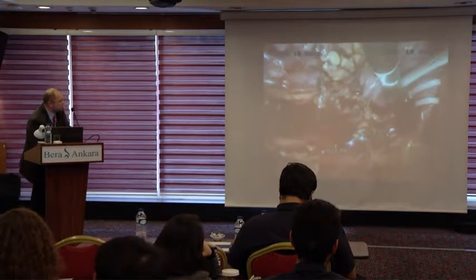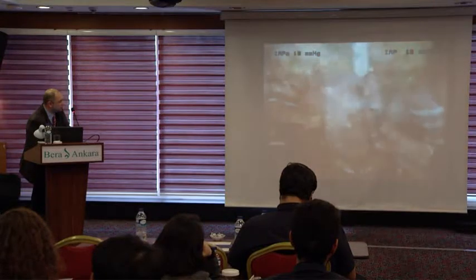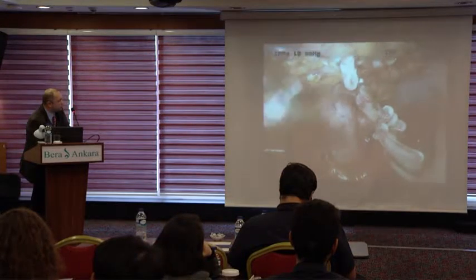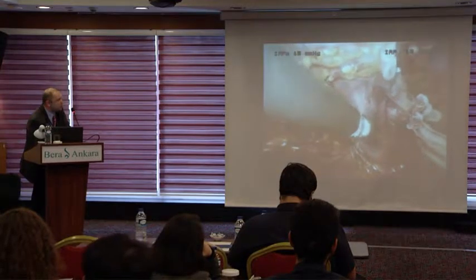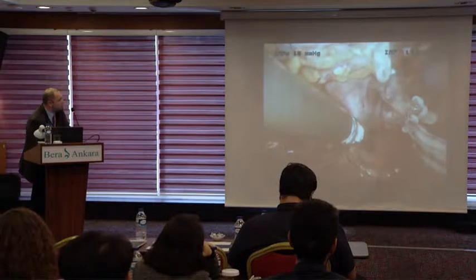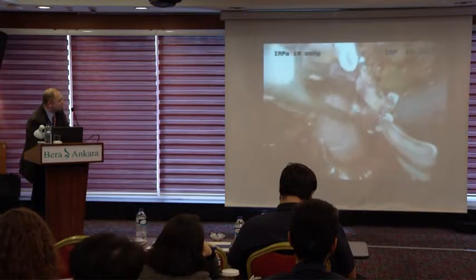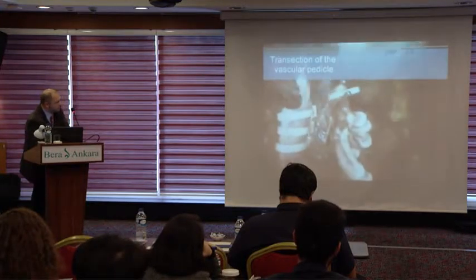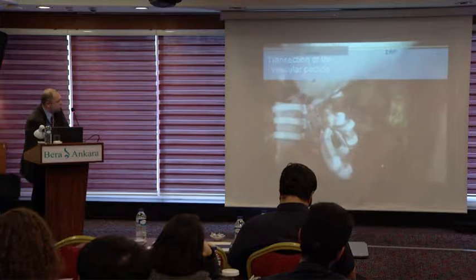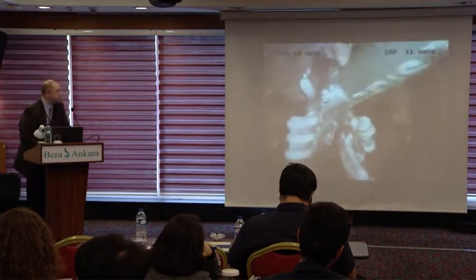At least 2 clips on the medial side, as I mentioned here. But he clipped the third to feel confident. This is the renal vein. We have to first clip the renal artery as a surgical rule. Scissors are used for careful cross-section of the vessels.